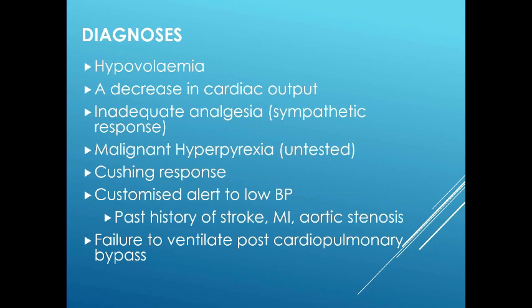It would be easy to suppress the diagnosis of MH, but it is possible a patient having a laparoscopy could develop MH. I think that the duration of the MH-like changes are unlikely to cause an alert, but it is possible.